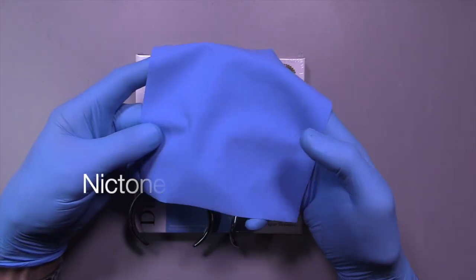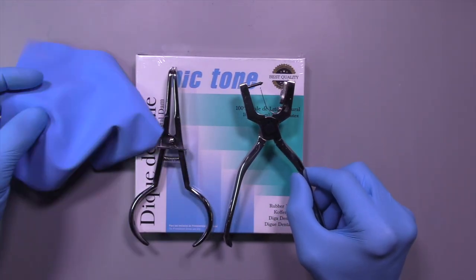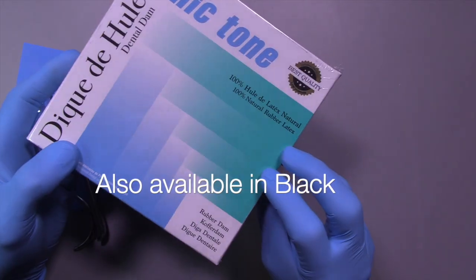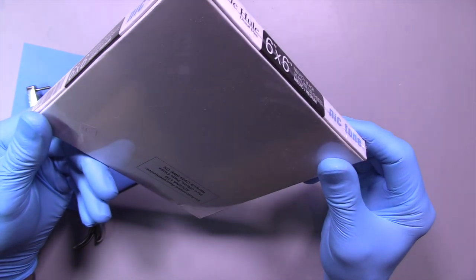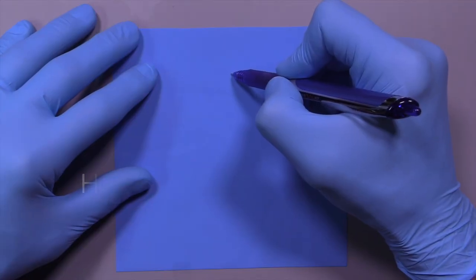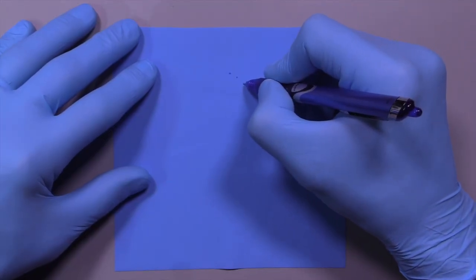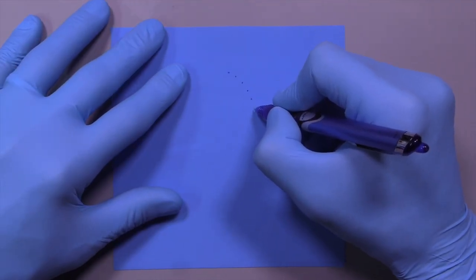Rubber dam has been mentioned in other videos but I'll go over this procedure again in case you haven't seen it. This particular product is definitely my favorite — I've been using it for many years and it's quite popular. It's available in black as well, which looks great for photography. For a maxillary rubber dam, we go one inch from the top for the central, then off at an angle as you go to the premolar, premolar, molar, and molar.